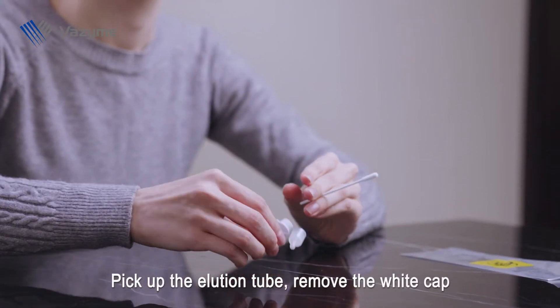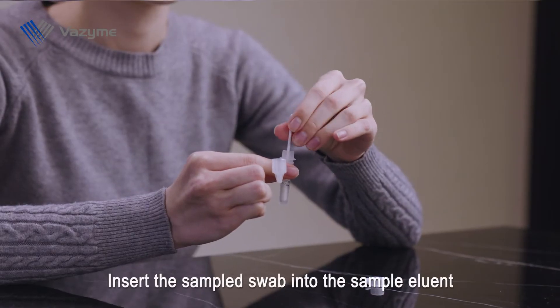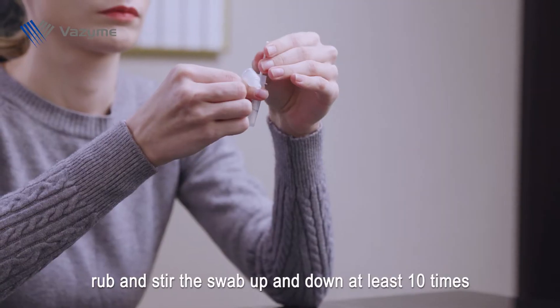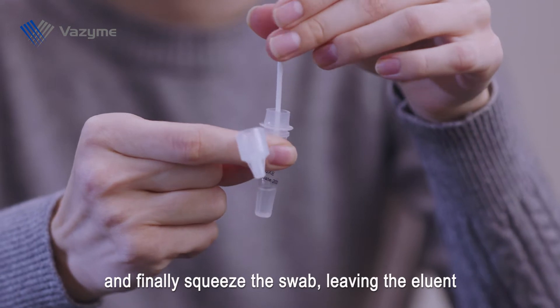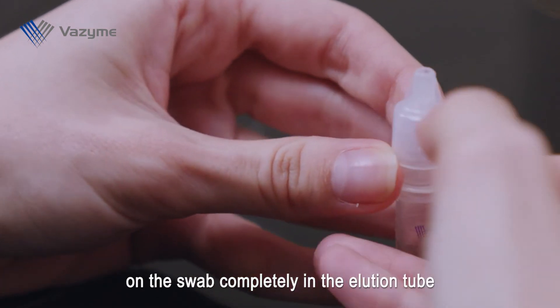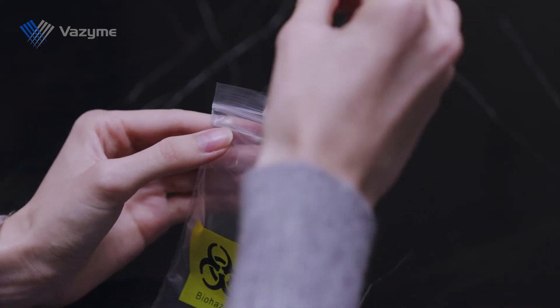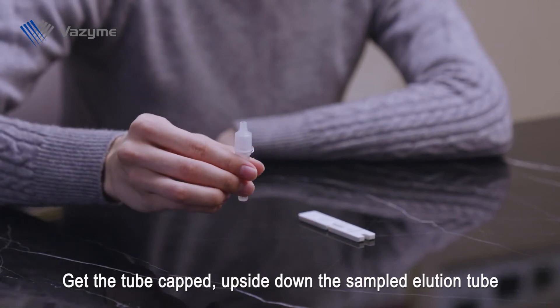Pick up the elution tube and remove the white cap. Insert the sampled swab into the sample eluent. Rub and stir the swab up and down at least 10 times. Finally, squeeze the swab, leaving the eluent from the swab completely in the elution tube.